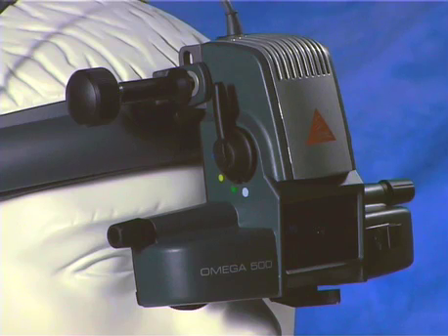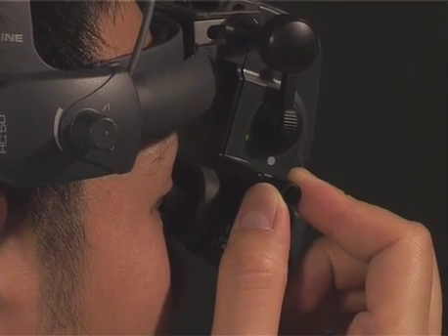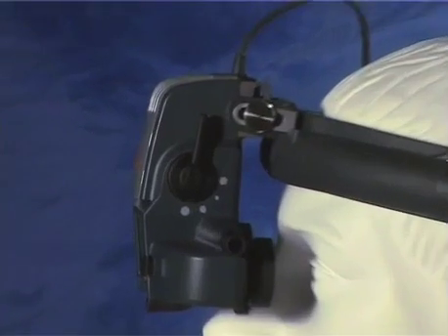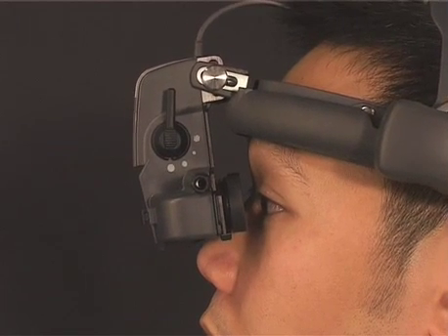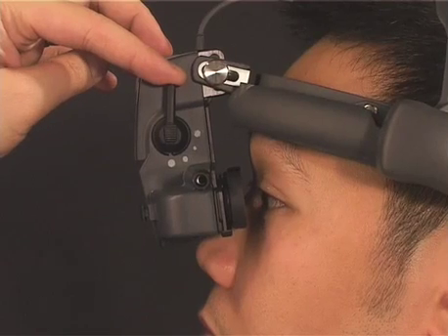Next, using the horizontally mounted knobs on either side of the assembly, the vertical angulation of the light is adjusted relative to your field of view. You should place the light beam in the upper part of your field of view for optimum visualization. Thirdly, adjust the spot size, choosing a diameter that's appropriate for your patient. For a well-dilated pupil and cooperative patient, the largest spot size gives you the widest field of view. However, in patients who are either photophobic or who have a small pupil, you should select a smaller spot size.